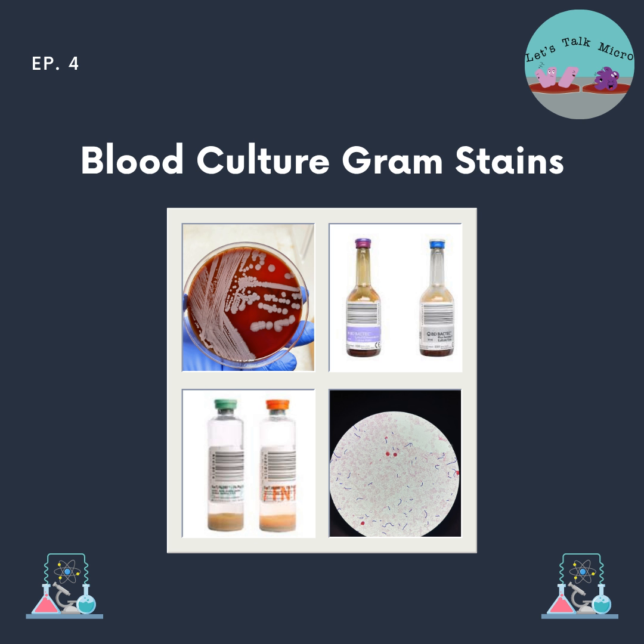And you document this internally. When you get your bottle and you don't see anything, you did the 50x, you did your cytospin slide, you don't see anything, you document that internally: NOS, increased white blood cells. And that's how you report blood cultures. You just have to make sure that if you don't see anything, you're thorough and do those steps. And then once you do that, put it back in the incubator. And if it's positive, it will flag later. So now you know what you're looking for. You know how to stain.